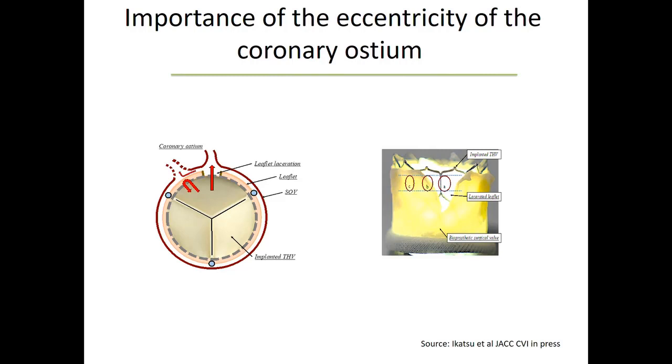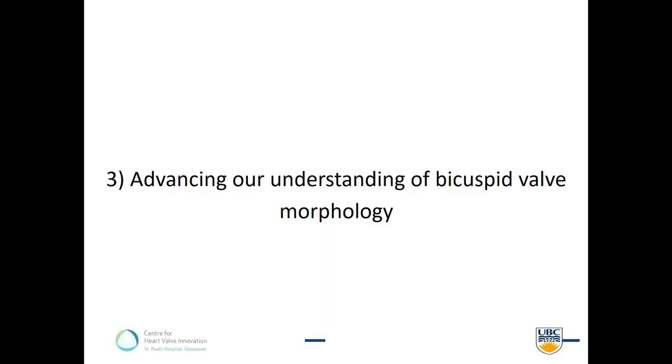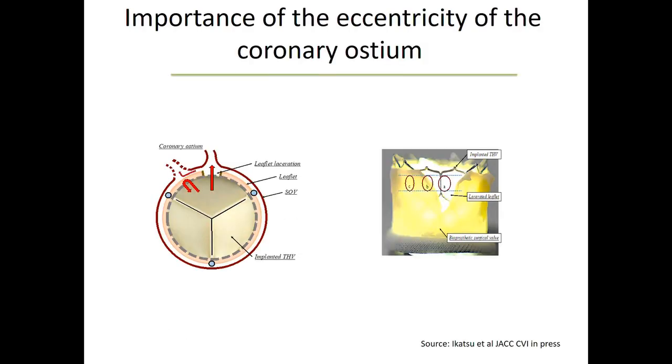But maybe CT can help us, because some patients, even if you do a Basilica, if the alignment of the posts is not respectful of the coronary ostia, you can slice it all you want, but you're not going to improve the flow. And so the eccentricity of the coronary artery, I think, will be something that we can identify.